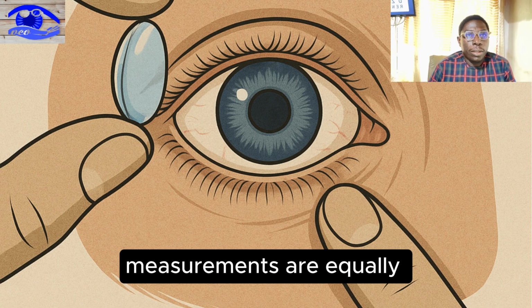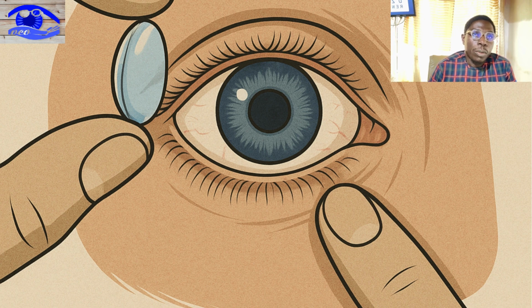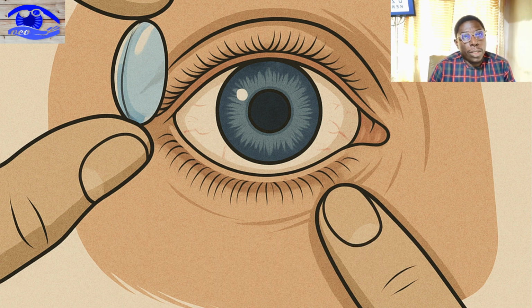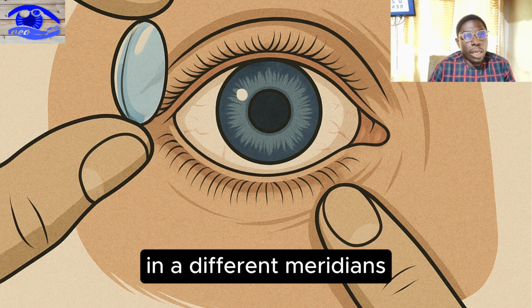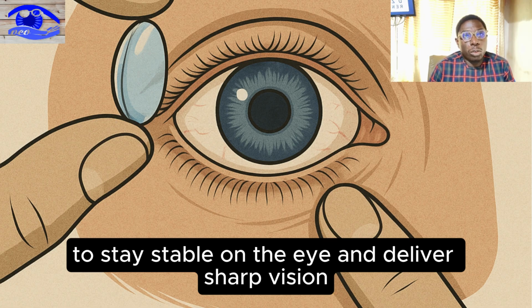Measurements are equally vital for toric contact lenses, which are specially designed for astigmatism. Since toric lenses have different powers in different meridians, they must match the cornea's exact curvature to stay stable on the eye and deliver sharp vision.